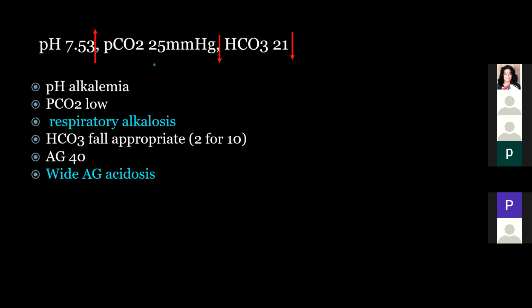The expected bicarb is 24 and we have got 21.